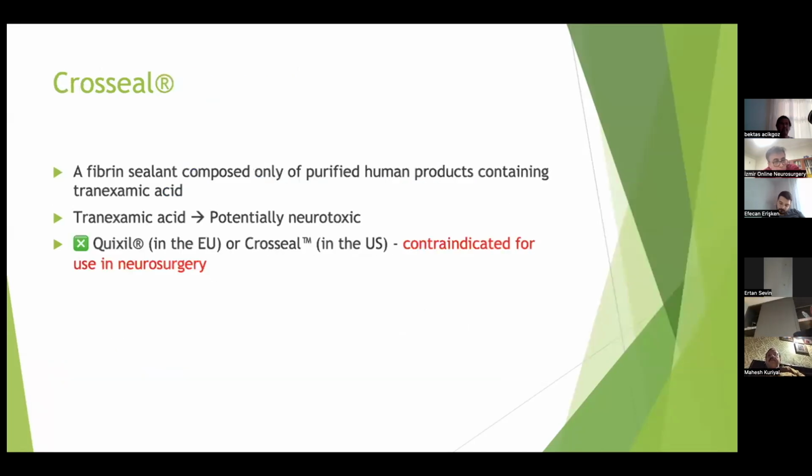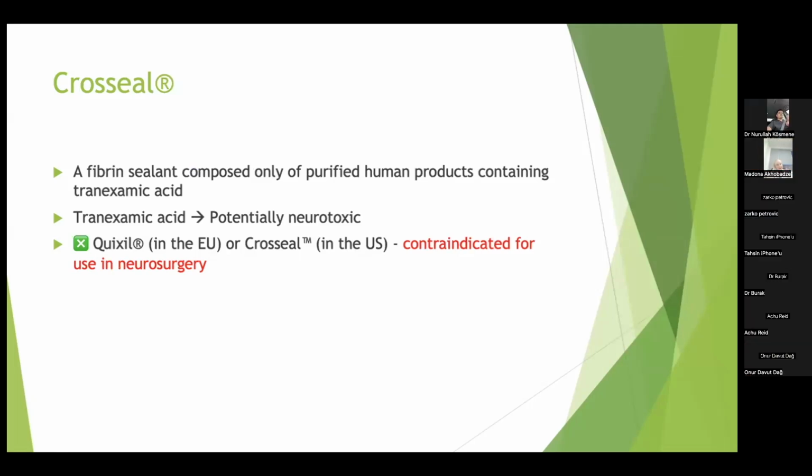Now, this is also worth noting, because this Cross Seal is a fibrin sealant composed of purified human products containing tranexamic acid. The tranexamic acid is potentially neurotoxic, and hence, finally, this was declared as contraindicated for use in neurosurgery.